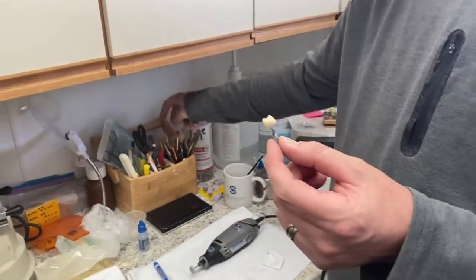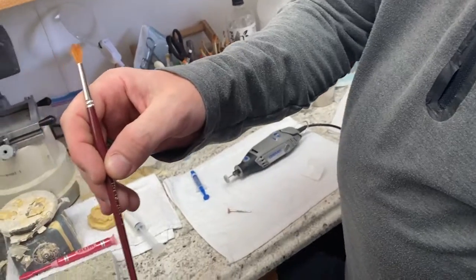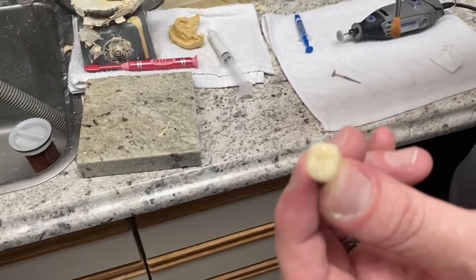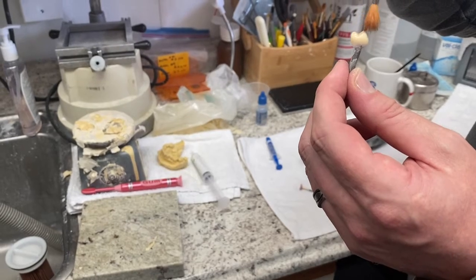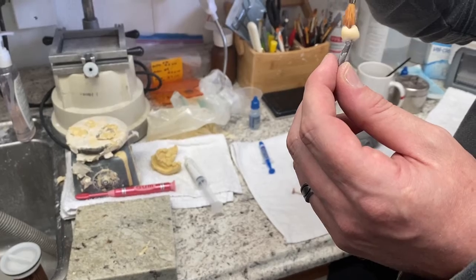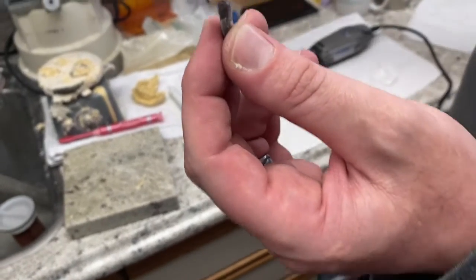But the last thing before we put it on the stand, you'll see that all the anatomy on the occlusal has been filled in by glaze. It's just not a real defined anatomy. So if you take your big fluffy brush, dab over the occlusal surface, you can soak up some of that extra glaze that's on the occlusal. Oh yeah, that makes a big difference. Now it's back to good defined anatomy.